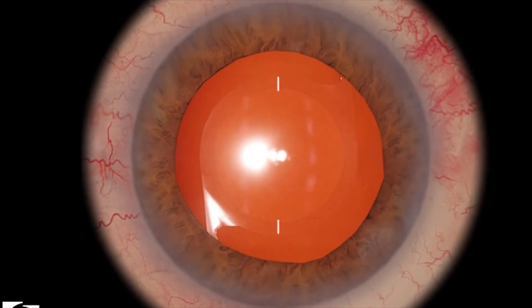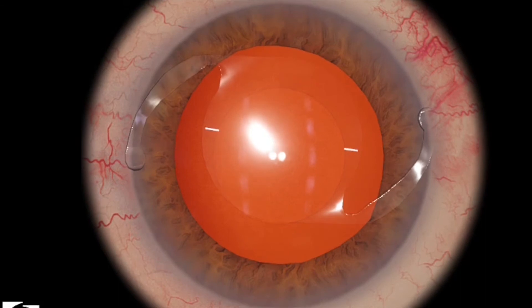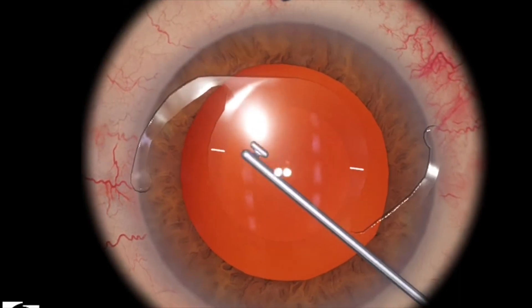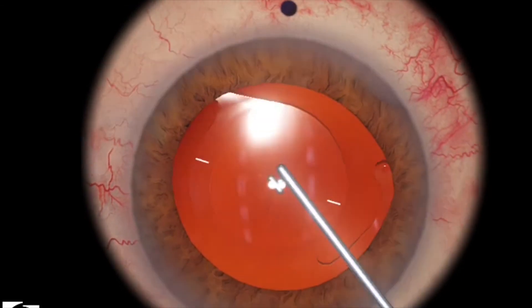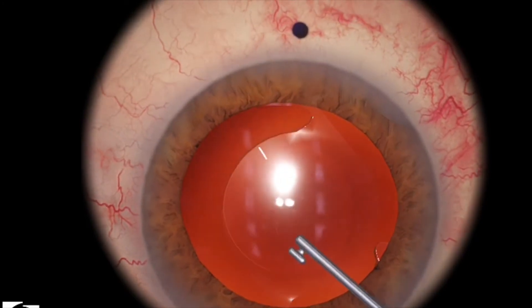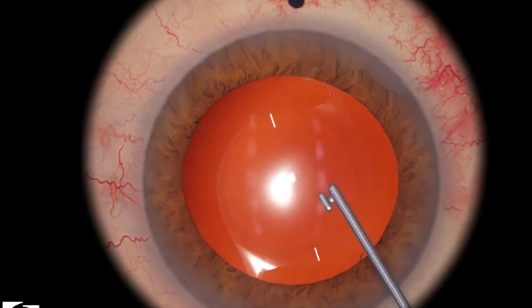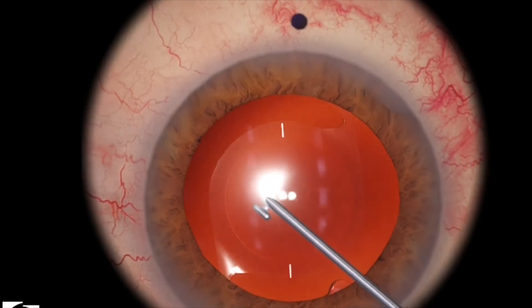That looks pretty good, a few degrees off, but I think it will relatively be in place. So again, try to use the push-pull technique. Push one end in, and then push the other end and rotate the lens back into place.